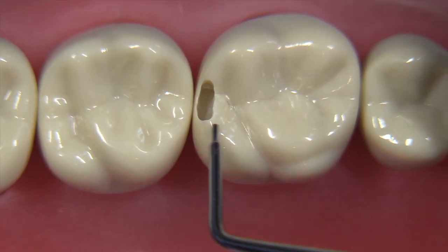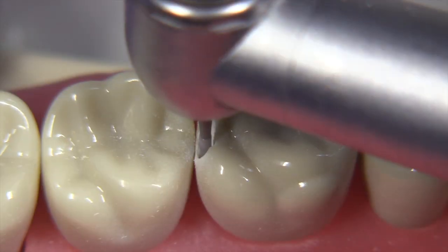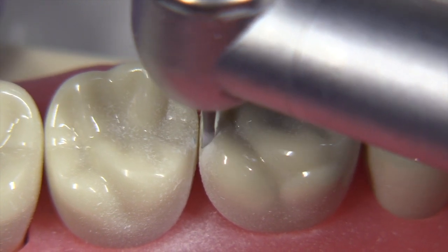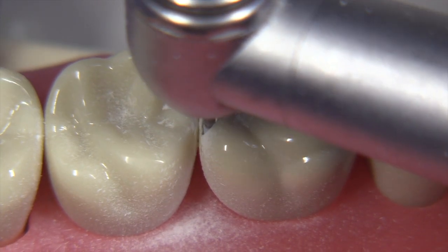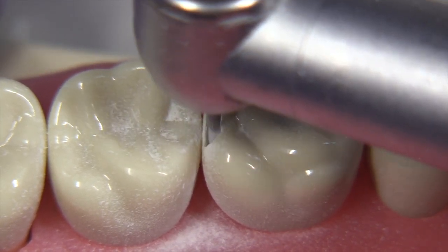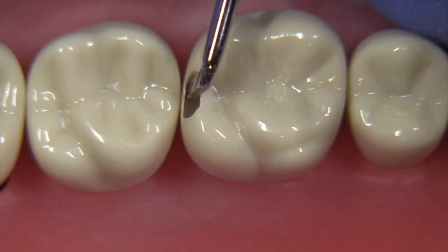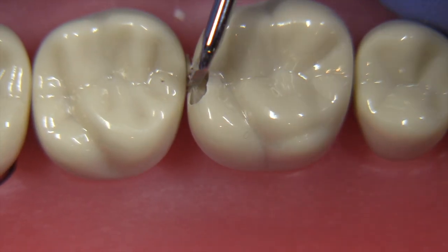You can see that there's a lot more extension required on that lingual side especially. Start at the top and work your way down. Generally when it comes to preparation design for operative dentistry - for boxes, for inlays, and for Class II composites or amalgams - I recommend that when you're extending your outline form you start at the top and work your way down, but when you're refining you start from the bottom and work your way up. Here we're just going to chip off a little bit of that shell so we can see what extension we have.